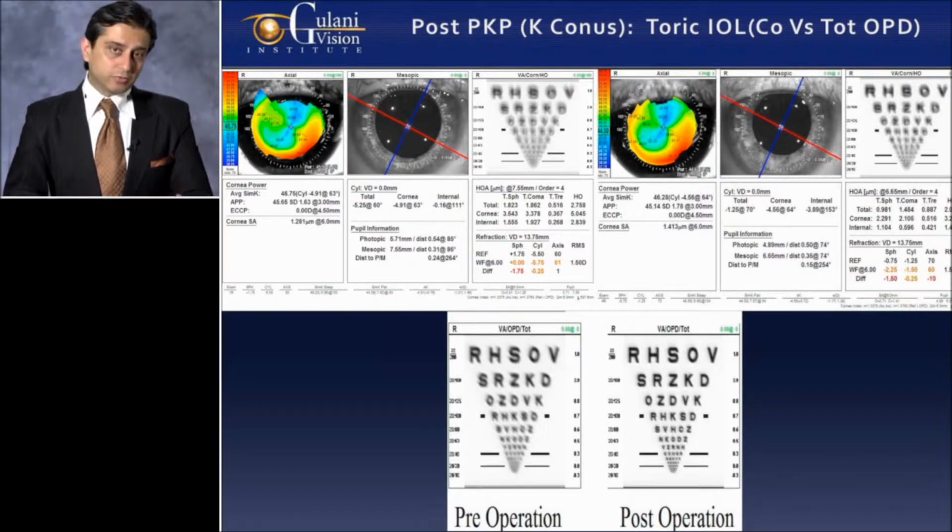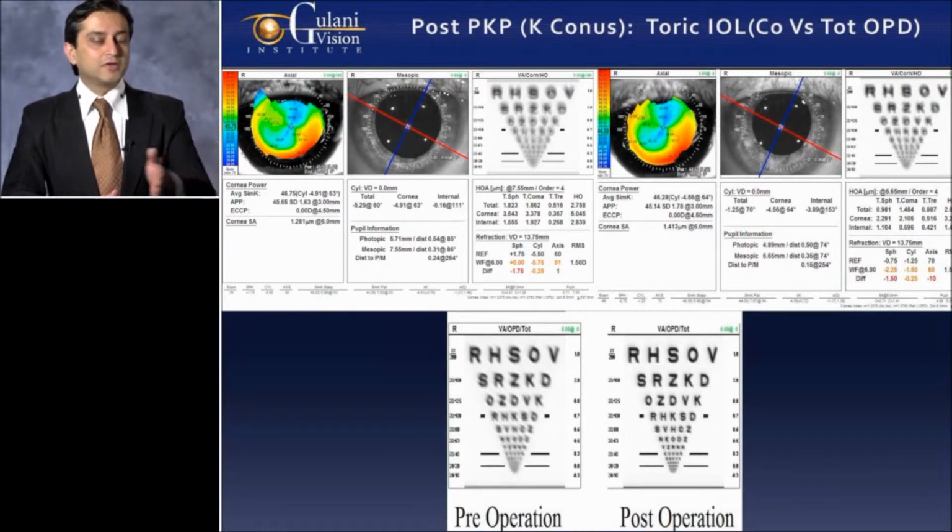So I would again like to reiterate, you're using the technology to first determine your plan of action, second, to determine did you execute correctly, meaning you're confirming it, and third, you're then looking at why exactly is this patient happy, and if not, what can you do to address it?